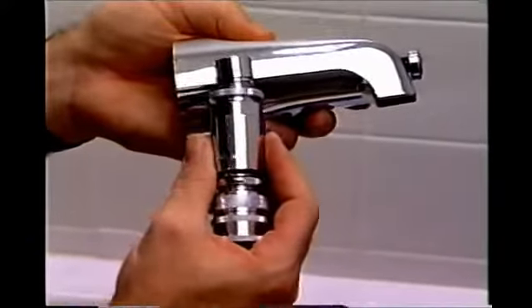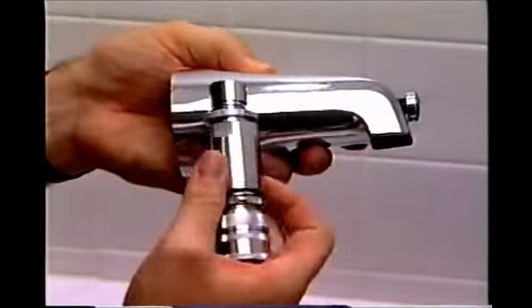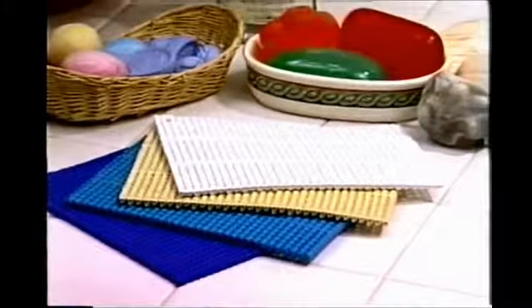For tubs that do not have a built-in shower, a tub spout with a side diverter will be necessary. Each lift and accessory comes with a removable non-latex machine washable cover mat.